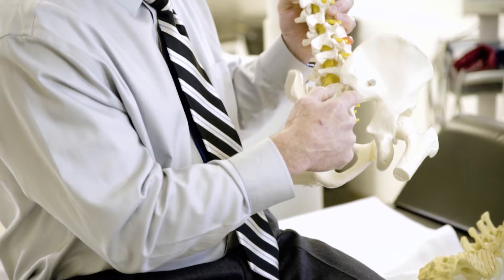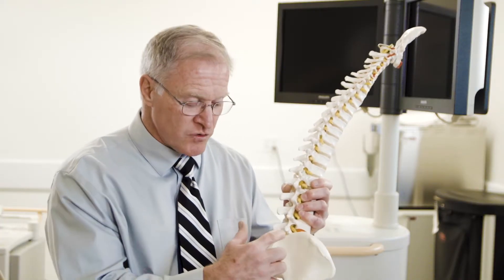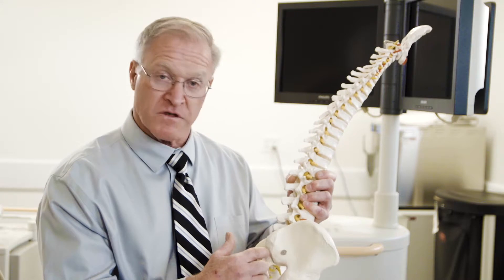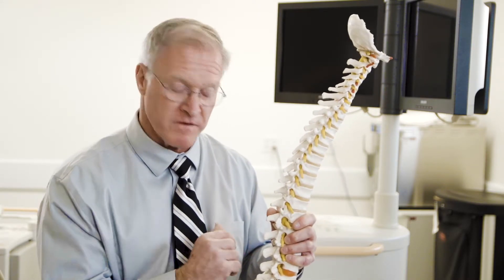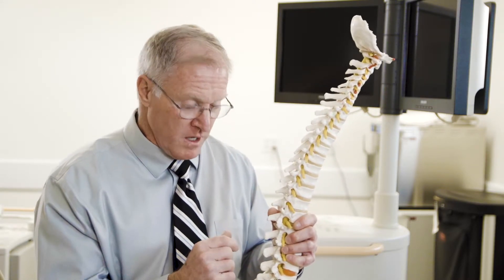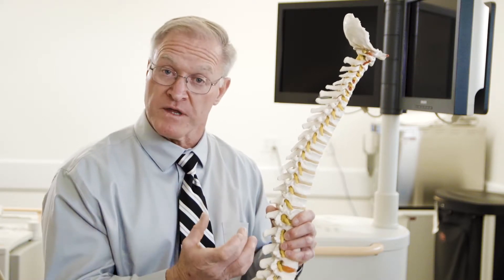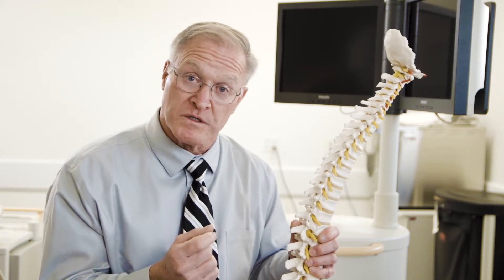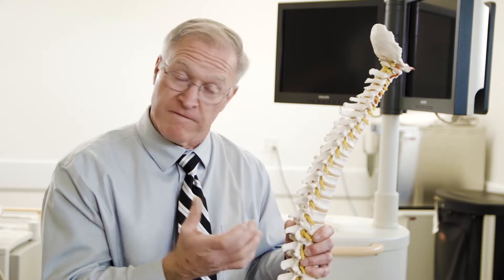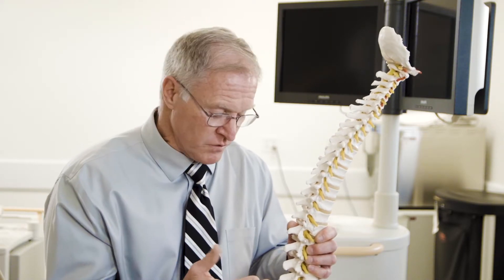Once we're visually within the joint, we want to confirm that the medication is treating the entirety of the joint, which is actually quite large — about the size of placing half of your palm against half of another palm. We want to fill that entire joint with local anesthetic, so the first thing we inject is a contrast agent, which fills the joint and gives us a picture called an arthrogram.